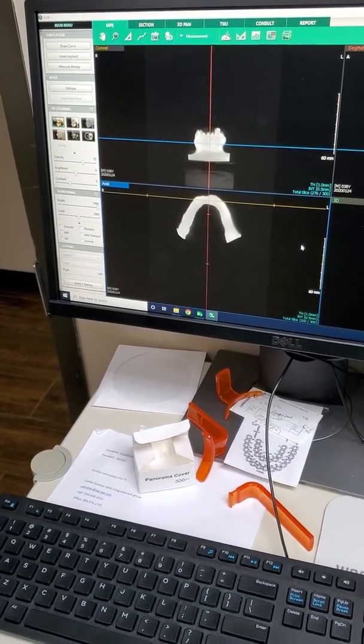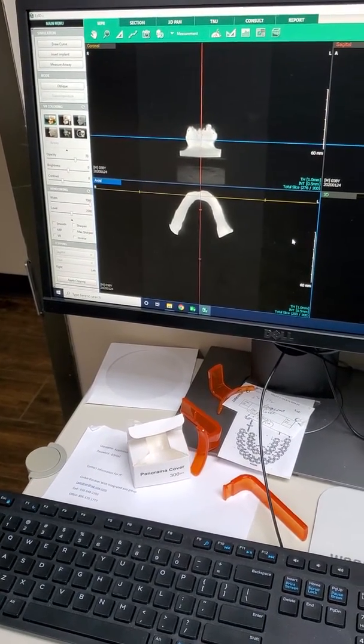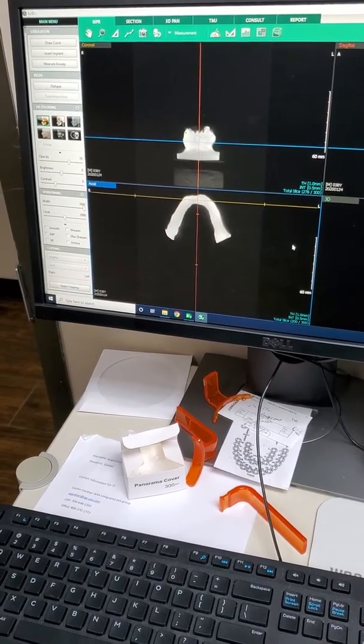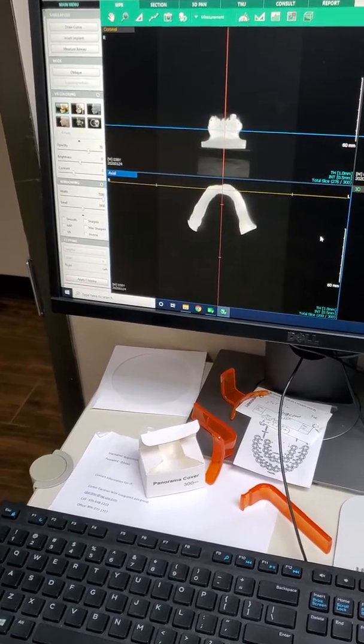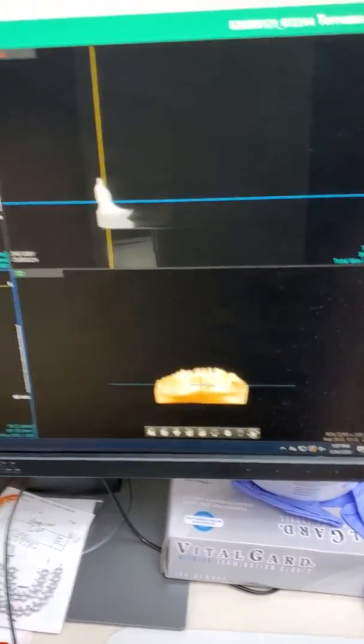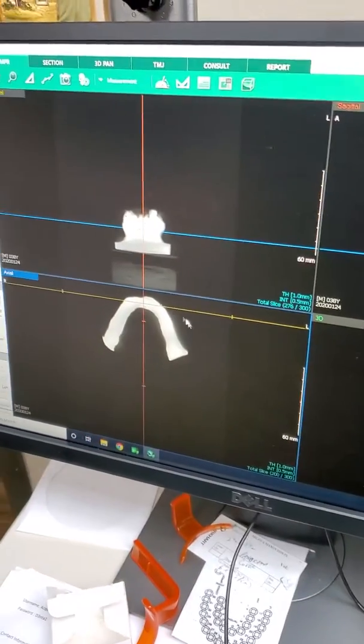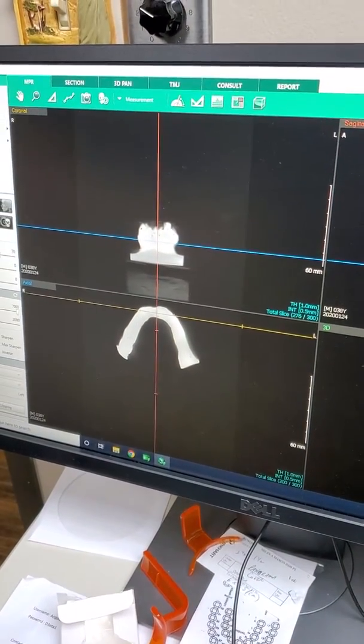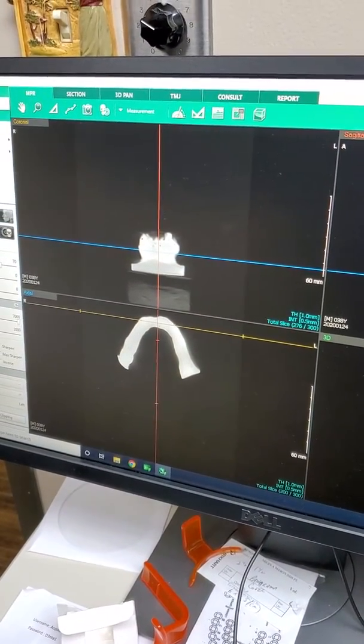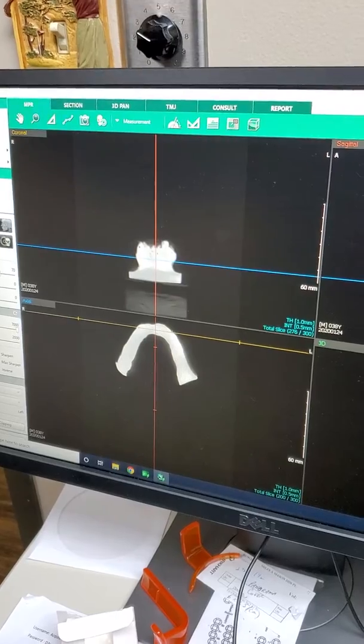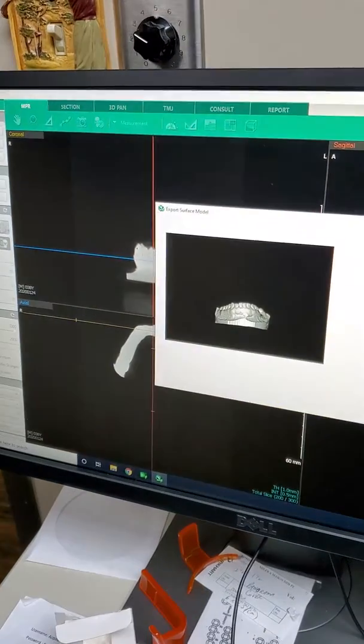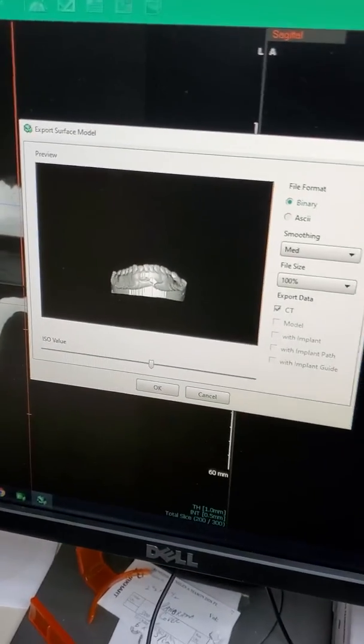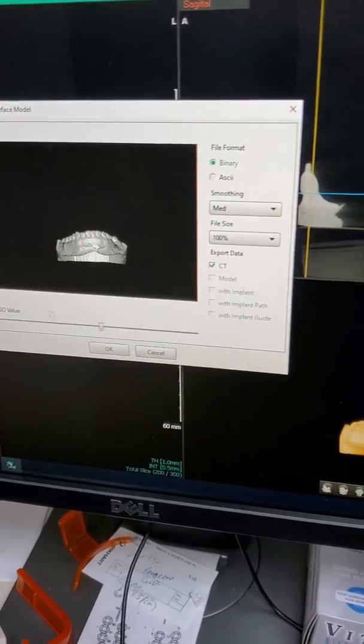What we just did was take a CT scan of the model, and then we opened the CT scan. We scrolled over to make sure it was on there, and we're going to go up to the top left to Main Menu, Export Surface Model, which should be an STL. Then this window opens.